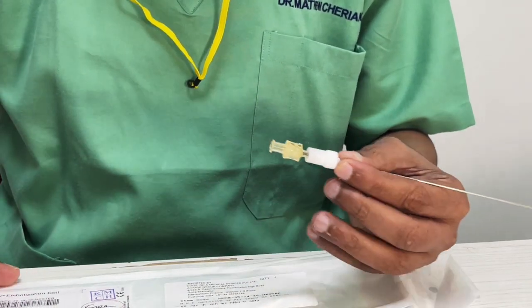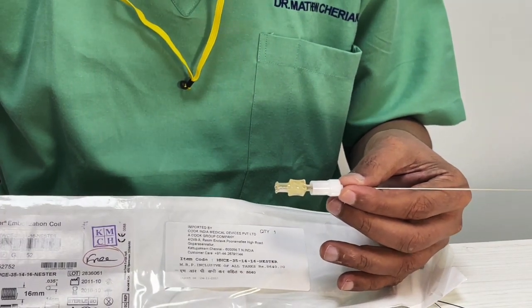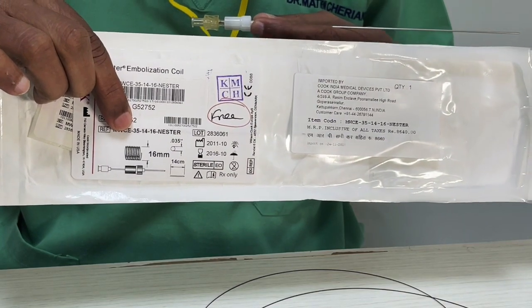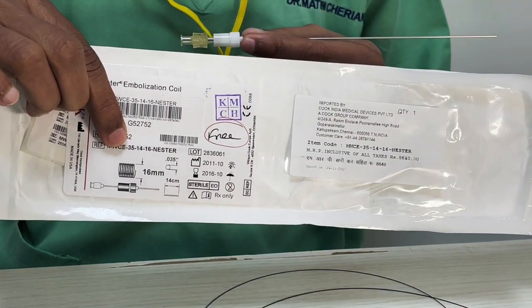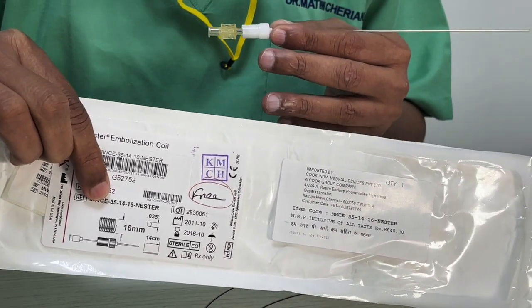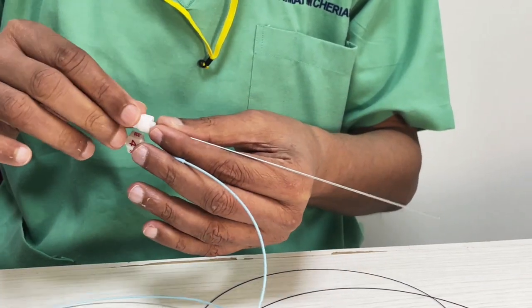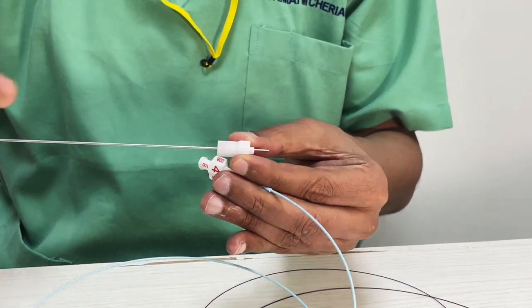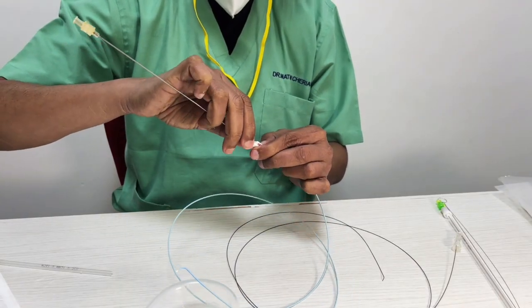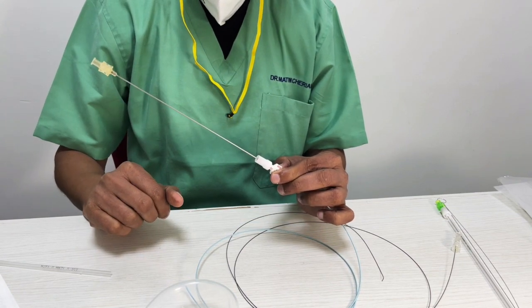So these are 3-5 coils. If you see over here, it is written Nestor embolization coil, and it's written 3-5 over here. Can you see the 3-5 written here? So the 3-5 means that it will go to any catheter that can take a 3-5 wire. So technically a 3-8 is perfect because it gives that extra space. So what you're supposed to do in real practice is this. You push this all the way down, bring it onto the hub, and you connect it this way. Now once you have connected it this way, you will find that it is very stable.